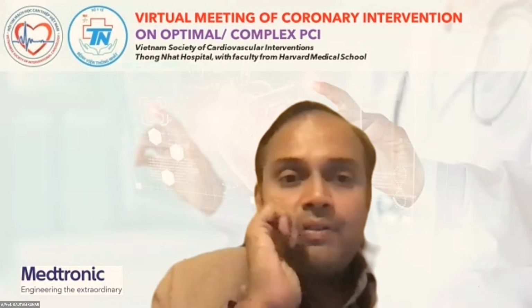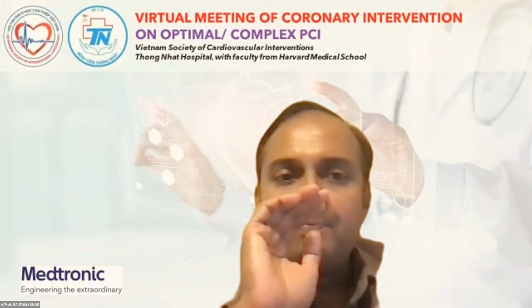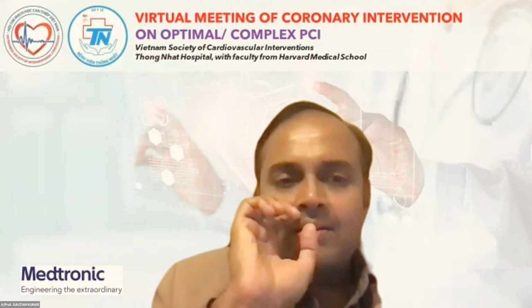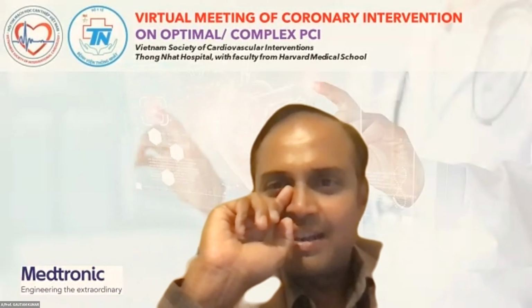But yes, I think you have hit upon several important points, especially that laminar flow, number one, is a very important point, and restoration of this laminar flow is an important part of what we do as interventional cardiologists. Now, how we restore it and the limitations that we have with that, I think that is going to be a great challenge in this area. So you have highlighted some important points, but I think we may need to do a lot more research to understand some of this better. And Tak, as you know, I have always said this, you're always many years ahead of everybody else in terms of thinking these ideas. And sometimes it takes time for the world to catch up with some of these things.